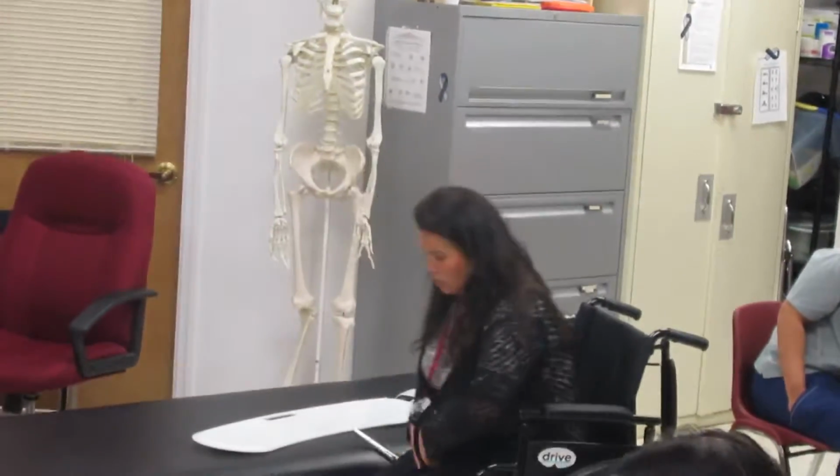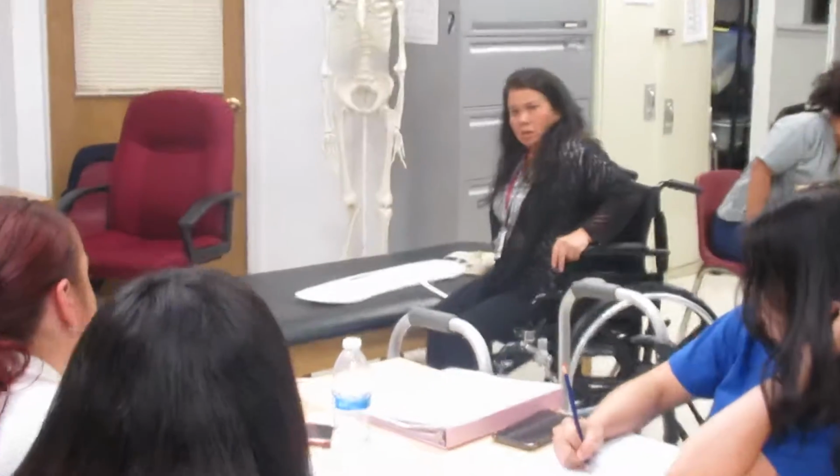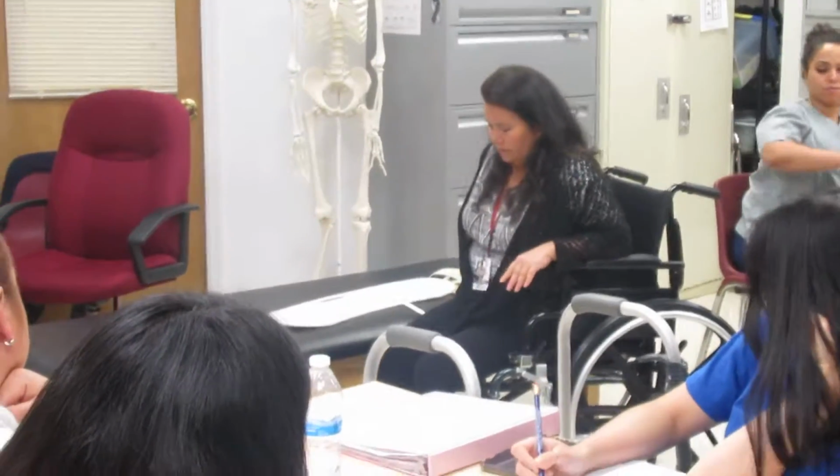Again, your patient will sit back here. You want them to slide forward as much as possible so they can even wiggle, right? When I use a slide board transfer, it's usually for somebody that can't stand. Maybe it's an amputation of one leg, but the other leg is way too weak for them to stand on. Or it could be somebody with a spinal cord injury. They can't use their legs. I might do this. So they're going to slide forward.